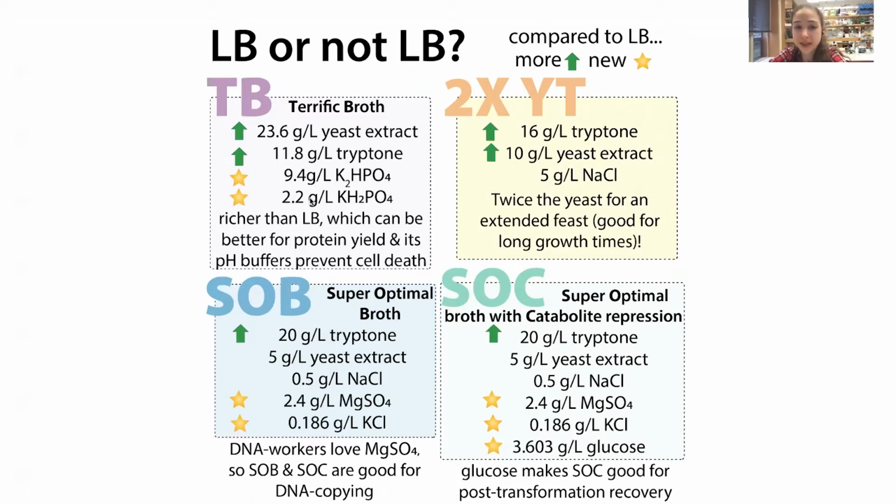So if you have these TB salts in there, if you have this potassium phosphate in there when you're doing the autoclaving, if you have it in the mixture of this, so basically you want to autoclave these separately and then mix them. The potassium phosphate can actually precipitate out some things in the broth, and this can cause problems because you're precipitating things out.